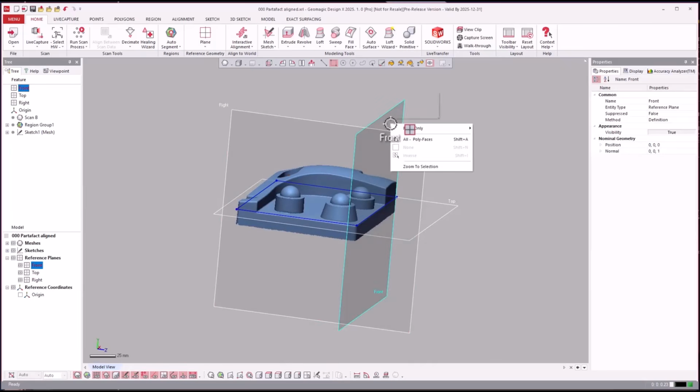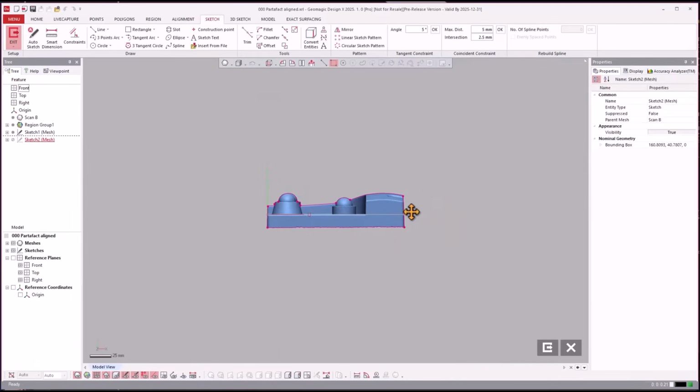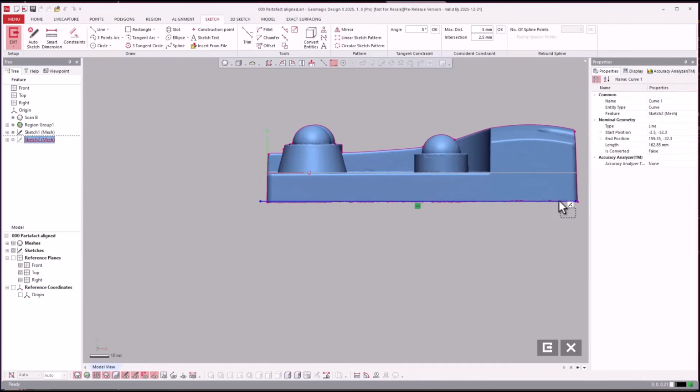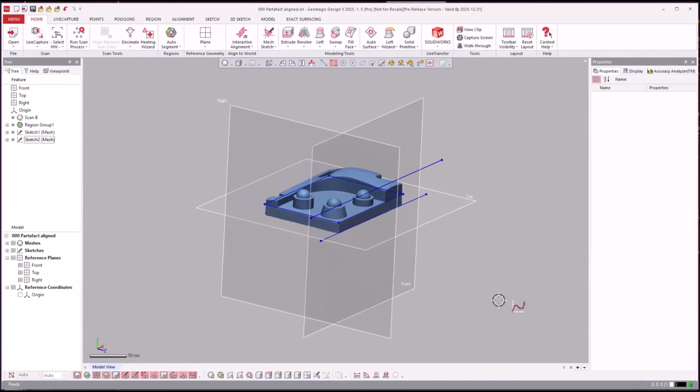And then if I need to, I can come over here also and silhouette this in the other direction. And come in and maybe draw a line horizontal and snap it there. Snap it over here somewhere. And same thing with this. You'll see that what I end up doing here is I kind of use this as a reference, and I like the way we have this resize tool in here. The resize tool inside of DesignX is neat. You can just click and drag instead of trying to trim and extend using tools, like drawing a line out here and extending up to it. With resize, I can just click and drag it, and it will keep the normal direction of the line. So now you see here that I drew a horizontal, and I drew these verticals.